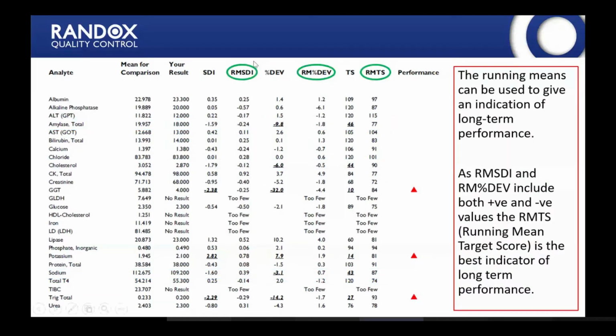So as we said, the running mean target scores are good for giving you your long-term performance indication. As Stephen said, it's the average of your last 10 samples. Again, with the running mean SDI and percentage deviation, we need to be careful. You can see here you have positive and negative values, and so these can average each other out and appear better than the actual performance might be. And we'll see that on some charts in a moment. So the running mean target score is the best one to look at to get a first glance indication of your long-term performance for the parameters.